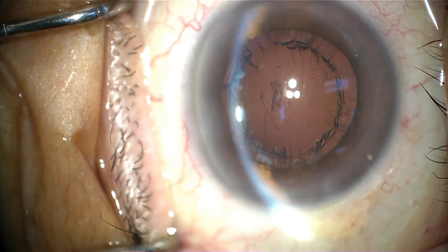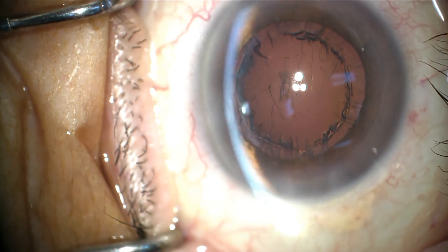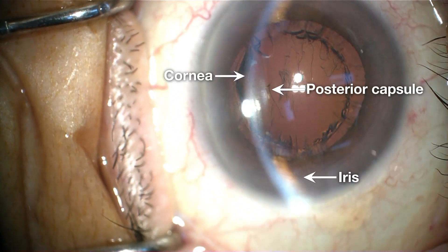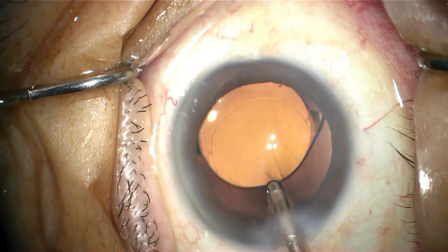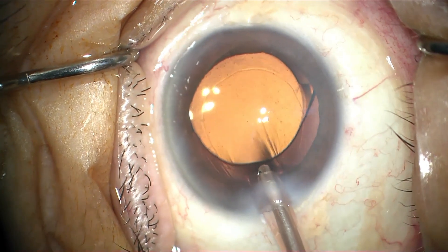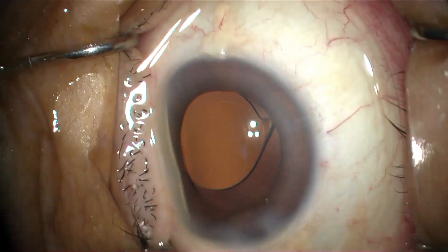With the help of an external slit illuminator, we can now observe the anterior chamber collapse and found substantial forward movement of the posterior capsule and iris. Moreover, after the final removal of the OVD with irrigation or aspiration, forward movement of the intraocular lens can sometimes occur.